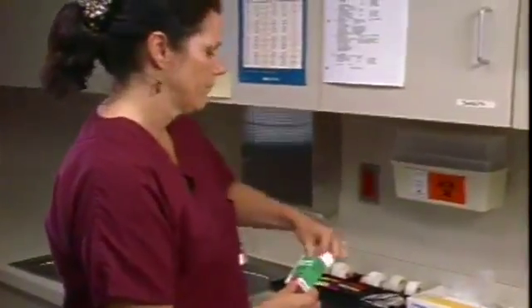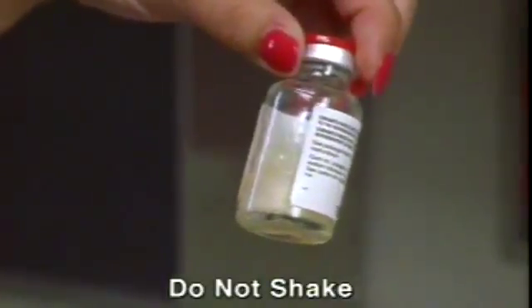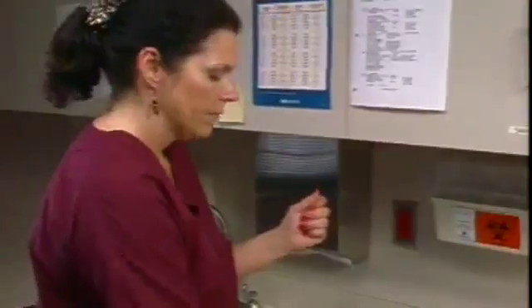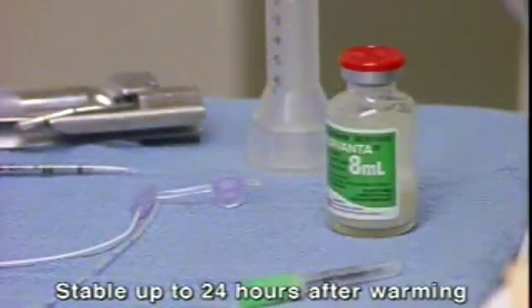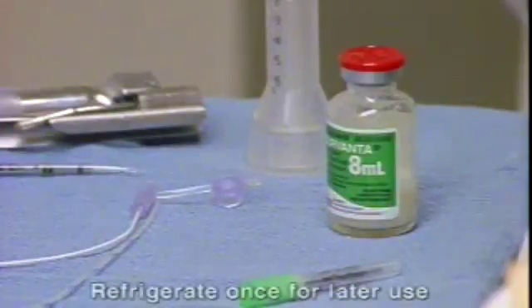Refrigerate Surfactant in the carton. Inspect the vials before using them. Surfactant should appear off-white to light brown. Swirl the vial gently. Do not shake it as it may foam the suspension. Warm it to room temperature before use. Never warm Surfactant using artificial methods. Surfactant remains stable up to 24 hours after warming. If it is not used within that period, it may be refrigerated once for later use.